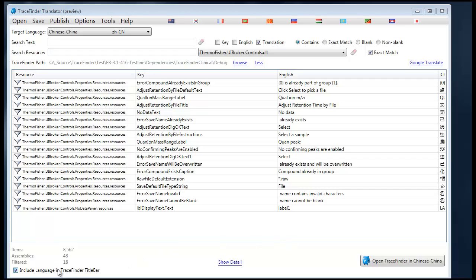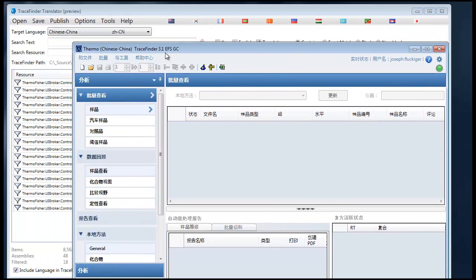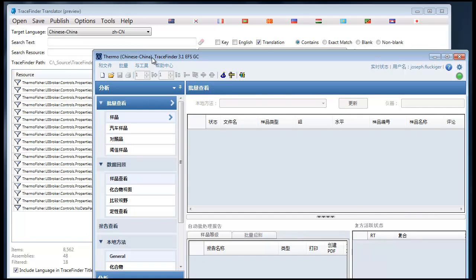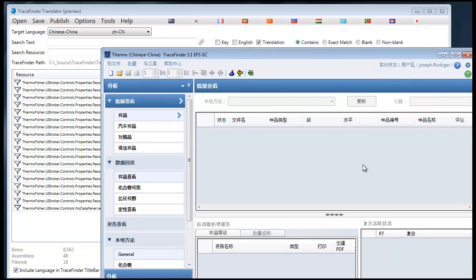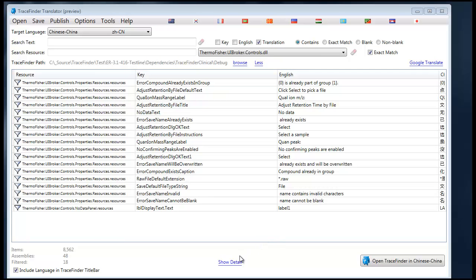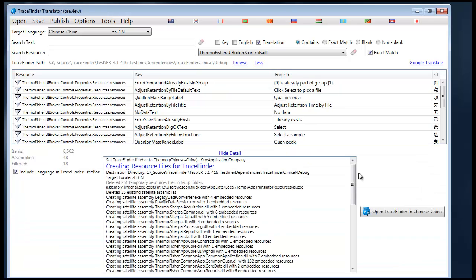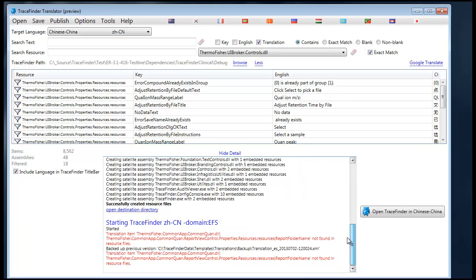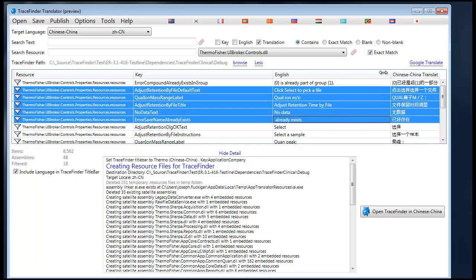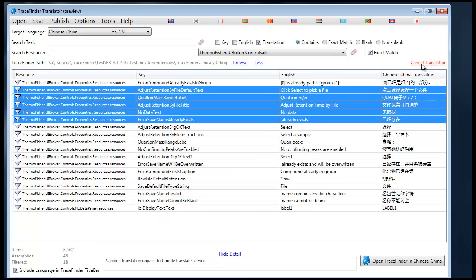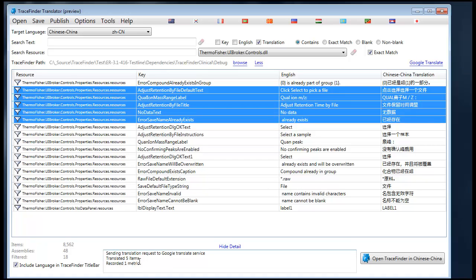The 'Include language in TraceFinder title bar' option simply causes the language text to show up in the title bar of TraceFinder, making it easier when you're switching between languages to know that your translations are taking effect. And finally, the 'Show Detail' button will give additional detail of what's going on behind the scenes, for example when you are submitting a translation to the Google Translation service, you can get feedback about what is going on during that operation.